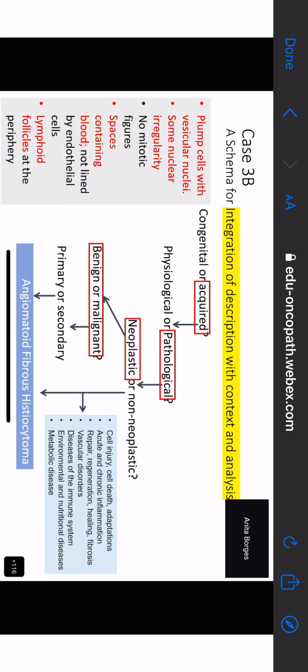And for epithelioid hemangioendothelioma, you may not have epithelioid lined spaces, but you should have blister cells, cells with blisters, some of them actually containing a red blood cell. Okay, so never mind, you didn't make the diagnosis, but this is an angiomatoid fibrous histiocytoma.